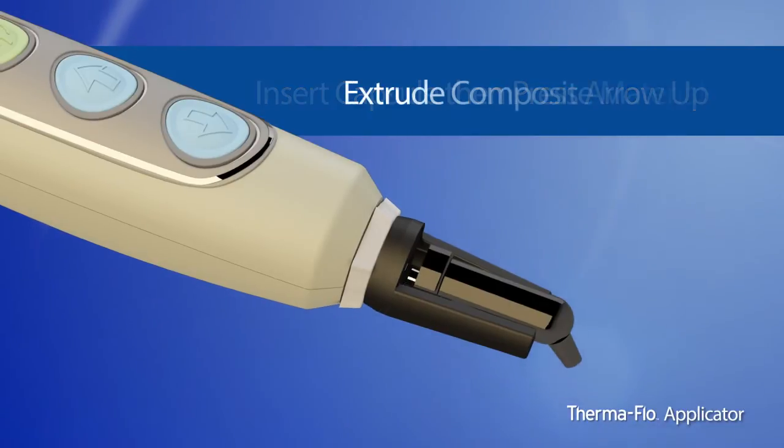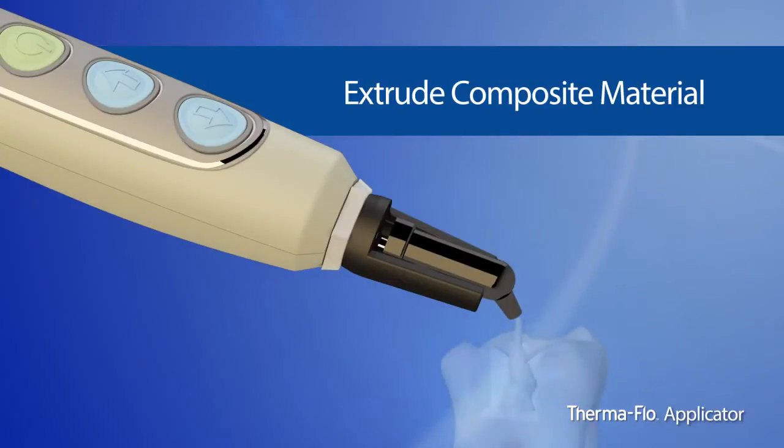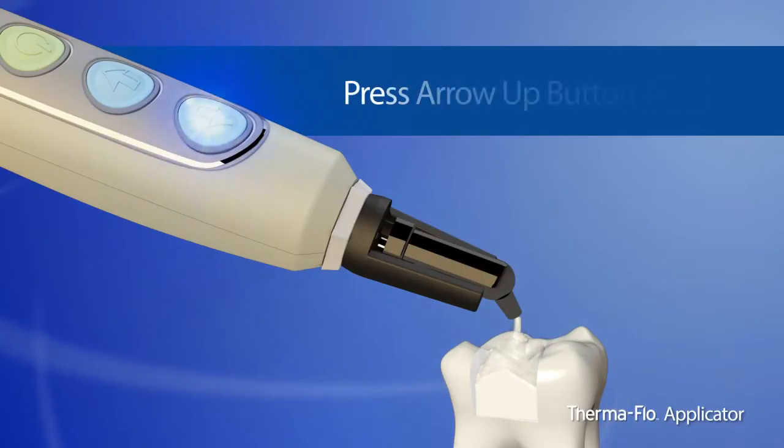Extrude the desired amount of composite material. To extrude the entire capsule, hit the arrow up button twice.